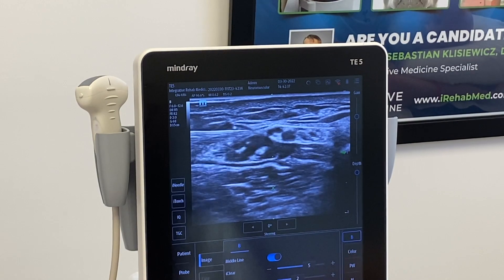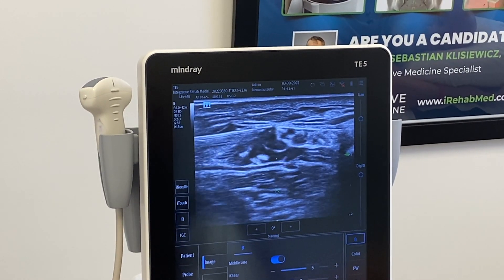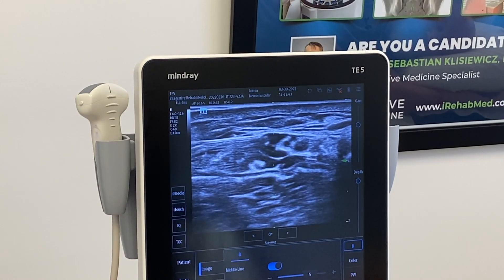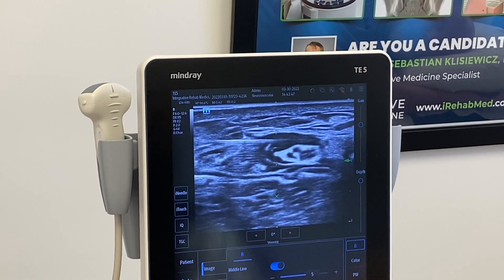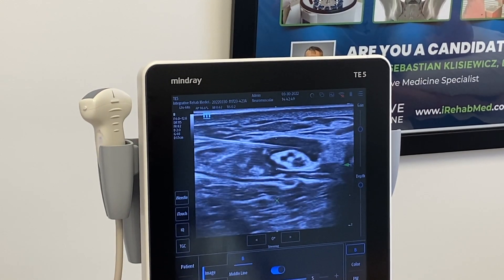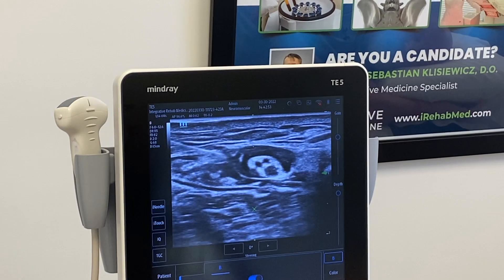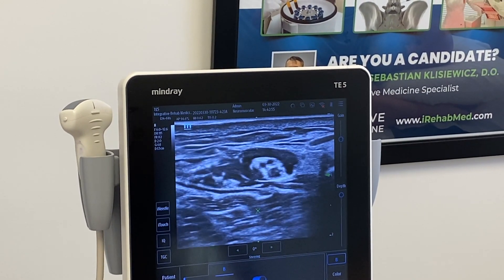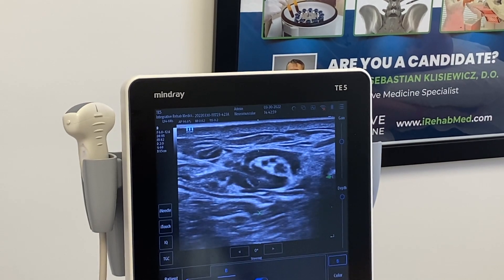I'm going to bring my needle above the nerve. The nerve is going to peel away — it's going to peel downwards. And there you go — there's the nerve. That's the hydrodissection component: we're releasing the nerve from any tension around it, and we're doing that with PRP which has all the growth factors to allow it to heal.